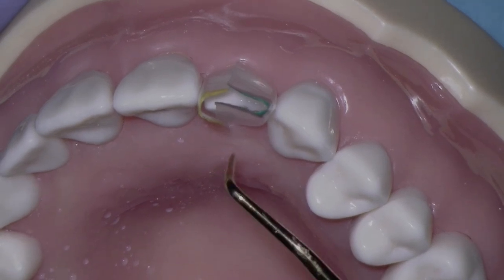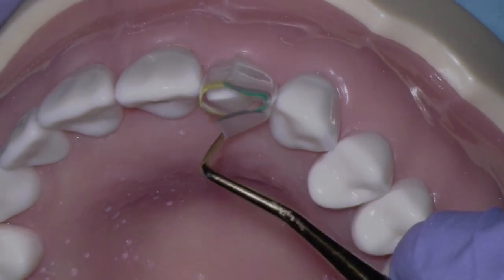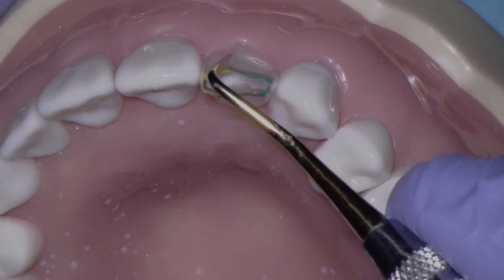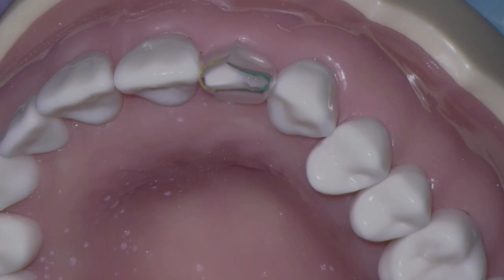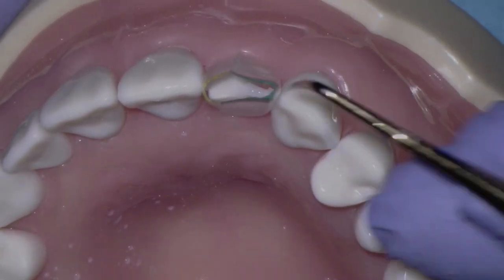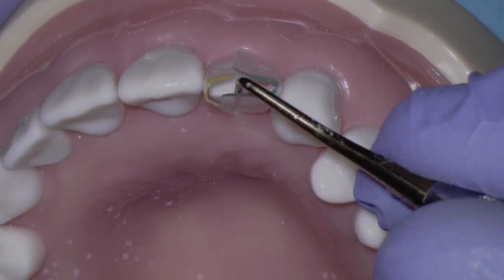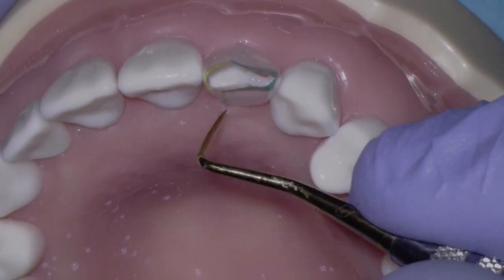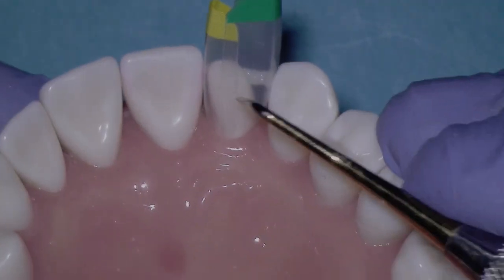Typically, it's an outside to outside relationship or inside to inside, where one matrix is either inside or outside of the other one, both on the facial and lingual. Realistically, the best thing you can do is to look at the arrangement and ask yourself, is it creating a good box? So once again, when I had the yellow on the outside, it was less helpful. So always check the arrangement of the flaps on the lingual with Bioclear. There's usually one setup that's better than the other.